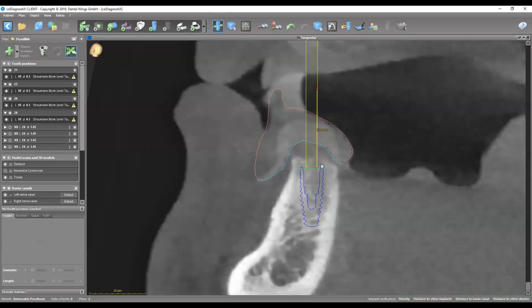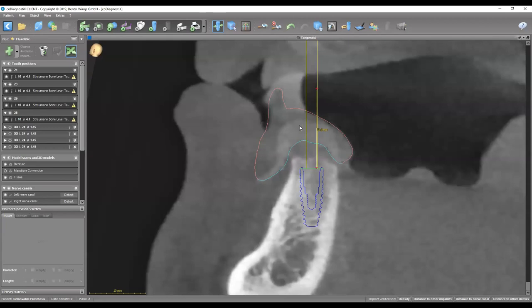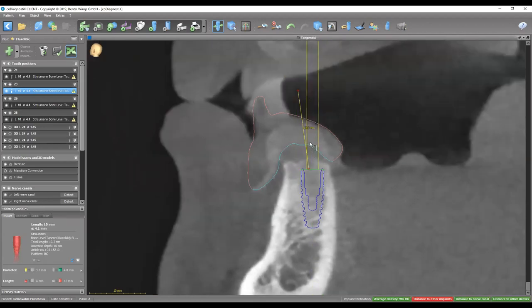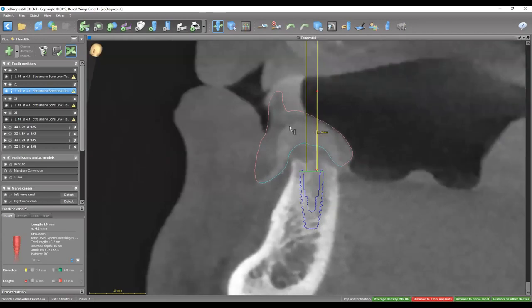We've also made sure the implants are perfectly parallel. We can see the implant midline or center, and the most important thing here is to place the implant in a position so the center emerges more or less out of the center of the intaglio. The reason is we're placing housings in the denture and we want enough acrylic support for those housings — the best position is the center where the most bulk of the prosthesis is. If you tip it towards the lingual or buccal surface, you'd still need adjustments. That was number 23 — bone support looks really good.